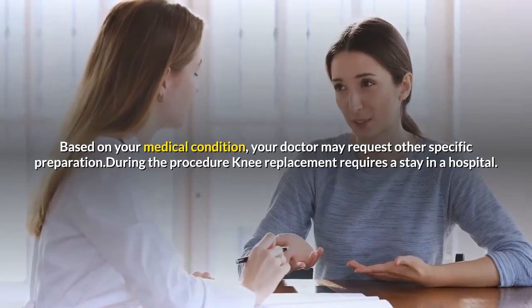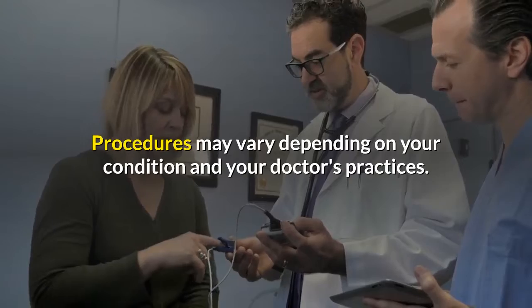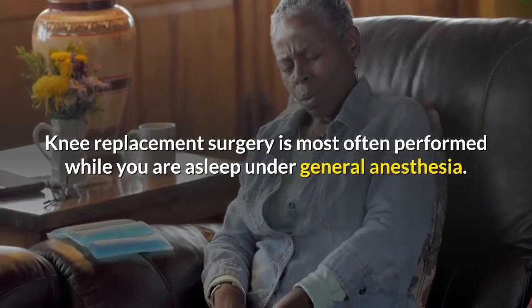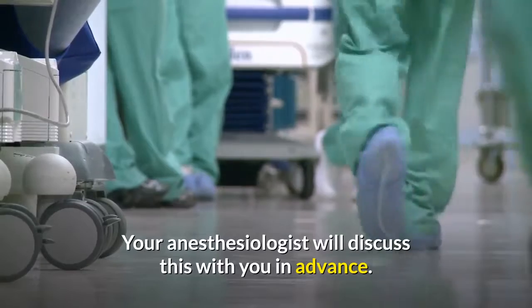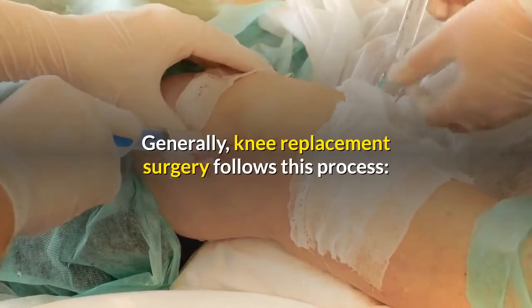During the procedure, knee replacement requires a stay in a hospital. Procedures may vary depending on your condition and your doctor's practices. Knee replacement surgery is most often performed while you are asleep under general anesthesia. Your anesthesiologist will discuss this with you in advance. Generally, knee replacement surgery follows this process.